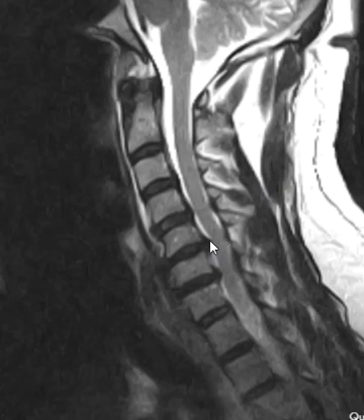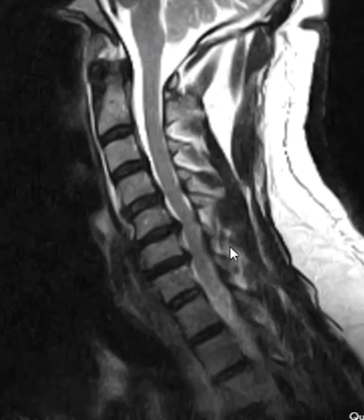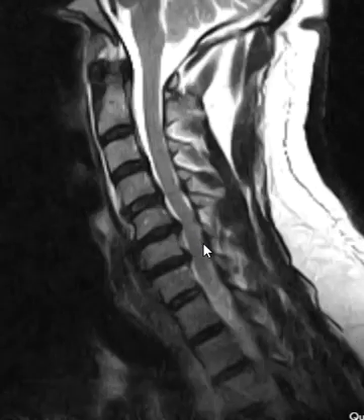And it's pushing and compressing on this thing. This gray thing comes out of the brain here. This is the brain stem. It comes down. This is the spinal cord. And coming down here, we see the spinal cord is flattened and compressed at this level. Also, another disc herniation here at this level is compressing the cord. So you have significant compression of the cord. There's this moderate central canal stenosis.